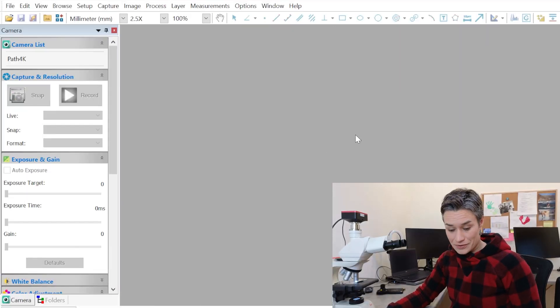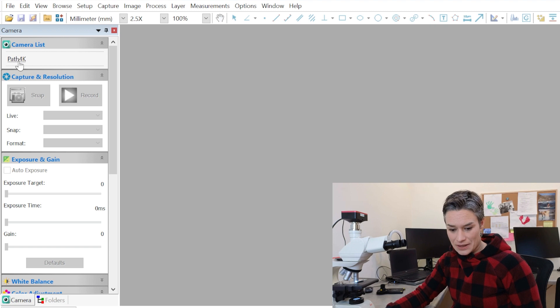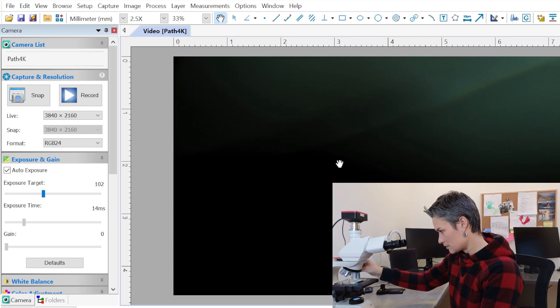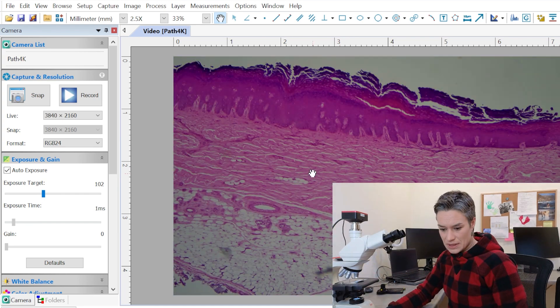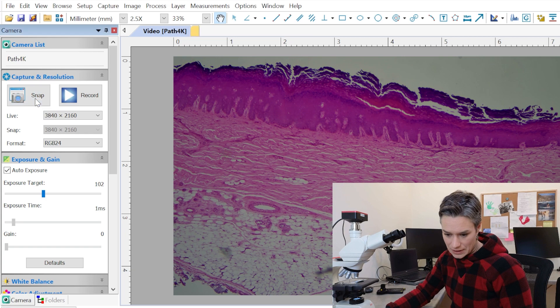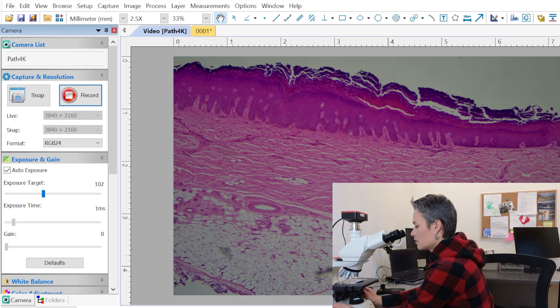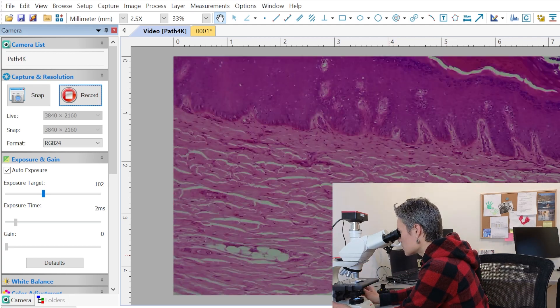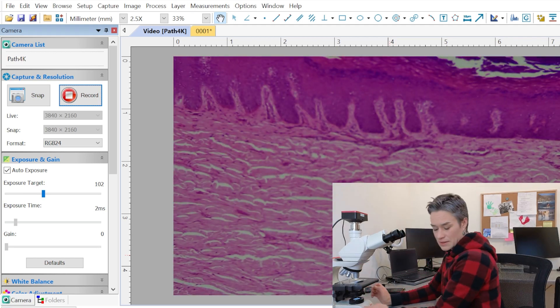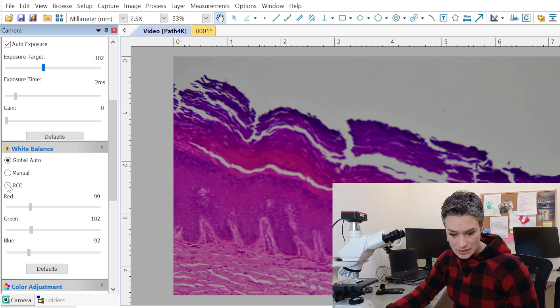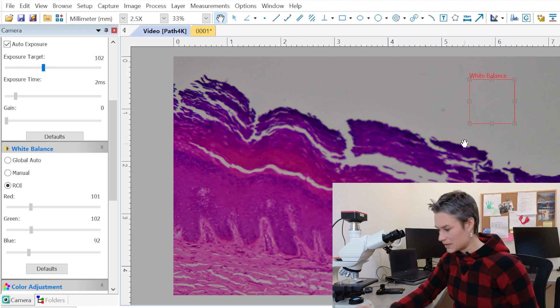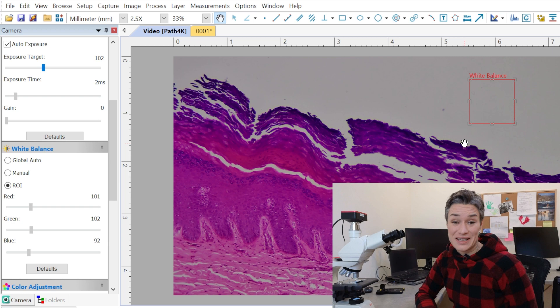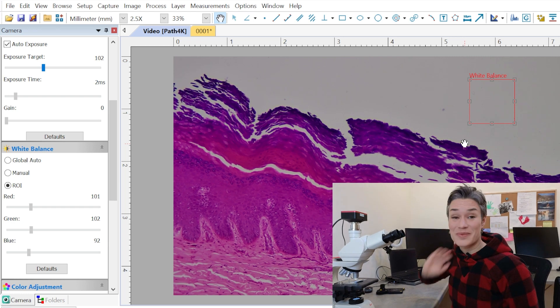Here we are in the InFocus software. We have our camera listed as PATH 4K and there's our live view. Let's go to a lower magnification so you can see everything I see. You can take a picture by clicking Snap, or record what I'm seeing if I want to move around and change the magnification. We can adjust the white balance using the region of interest on the white area, and then we have true-to-life colors. This thing is like a Mercedes in the microscope camera world.